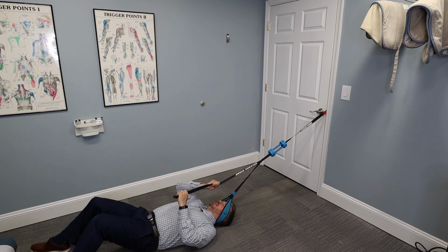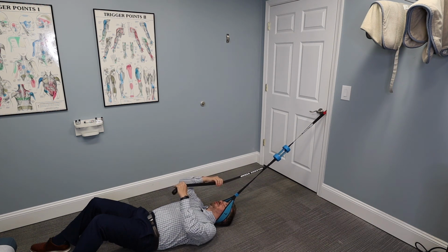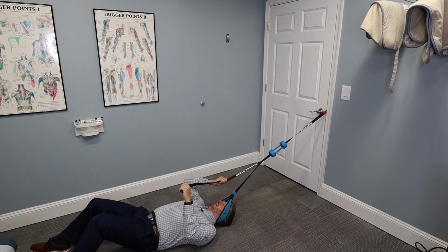And again, just like the low back, if I wanted to take tension off, I could just pull like that. And again, up in the neck, I typically want to stretch for 30 seconds, and then I want to relax for 15 seconds. So after that 30 seconds, just gently pull, you get that relaxation, and then you get the stretch.